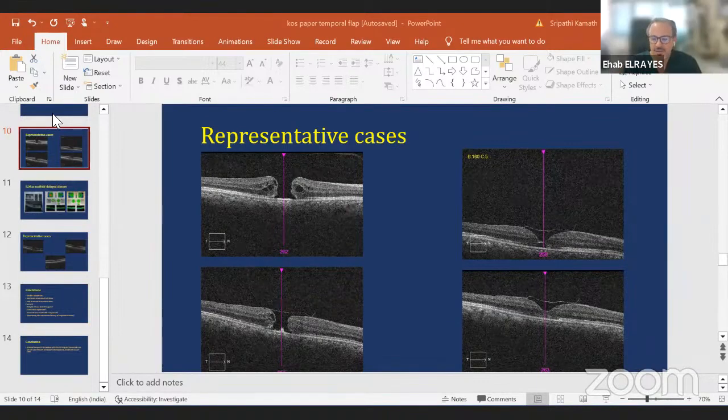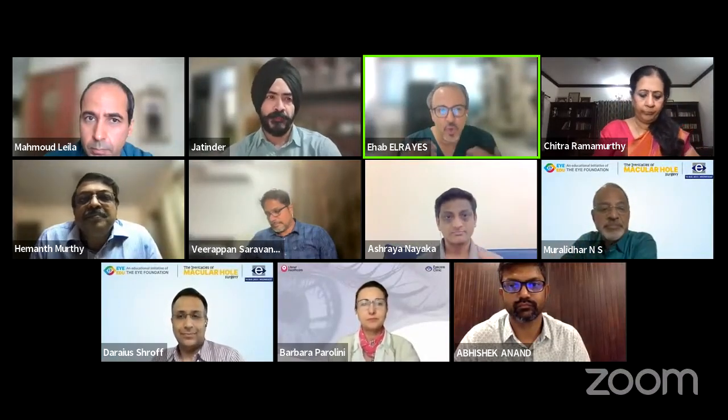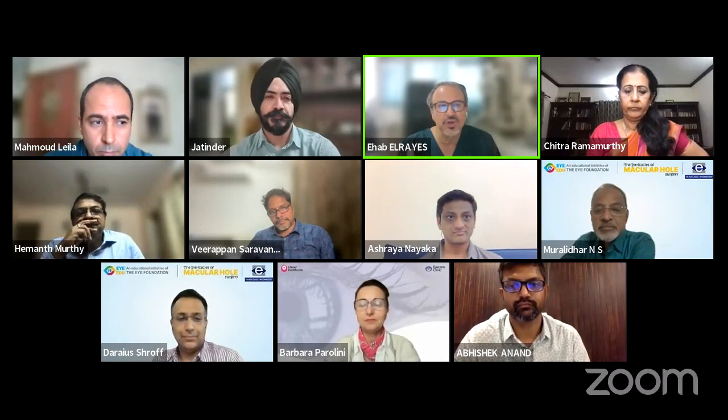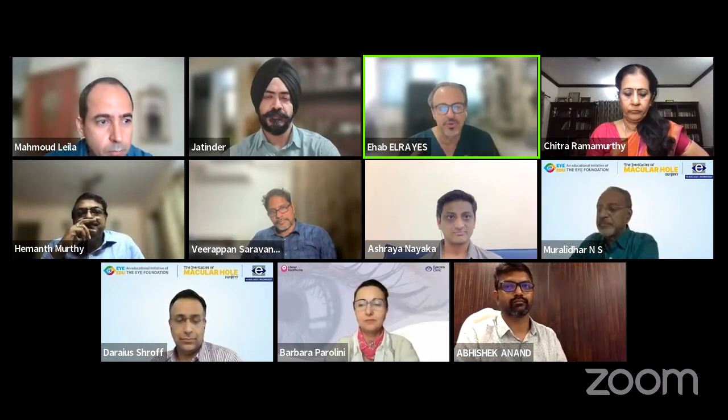All of them seem to work, as Dr. Elreis put. Yeah, I think the most important thing is keeping the fluid away from the central hole until it dries up. Theoretically, when we just used to put a really good gas bubble with good positioning, the hole used to close, especially when you increase retinal elasticity by removing the ILM. So closing the hole by any tamponade or whatever we put over the hole brings this chance of closure. The bad thing now is that with more things we use over the holes, it's not just that it might prevent closure if it goes inside, but it actually stays there forever. I think the next debate will be what type to put over the hole. Though they help in closing the hole, we ask ourselves what they are going to do if they stay over the retinal surface, whether it's amniotic membrane or retinal transplant or whatever.